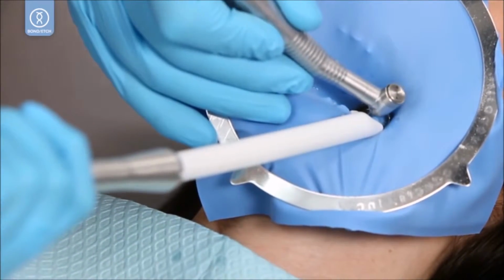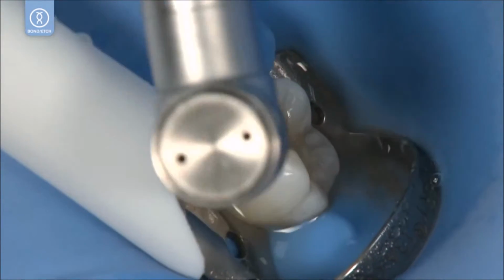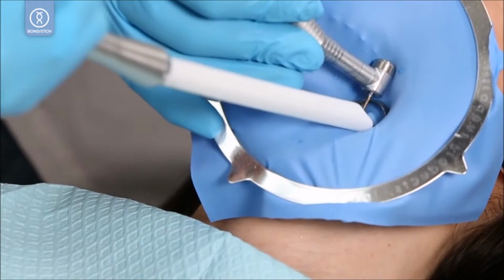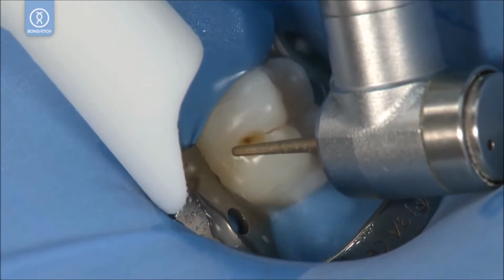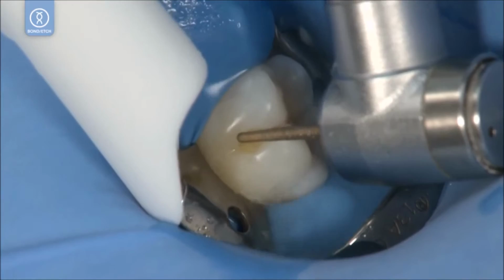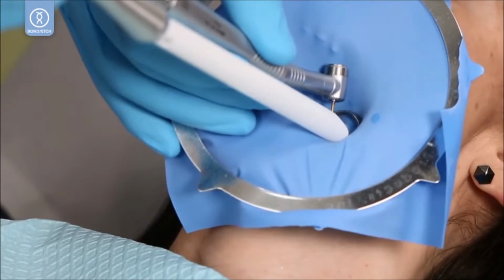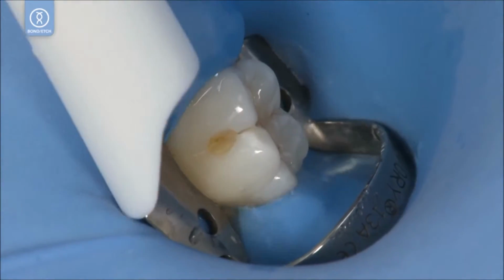Remove amalgam with a carbide burr. Refine the prep with a diamond burr. Rinse and vacuum, lightly dry.